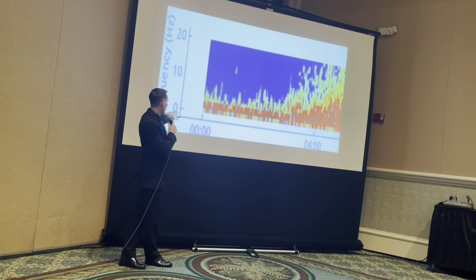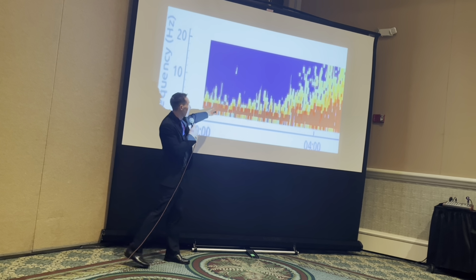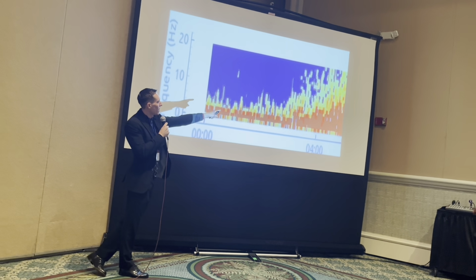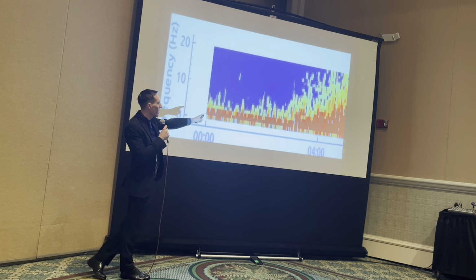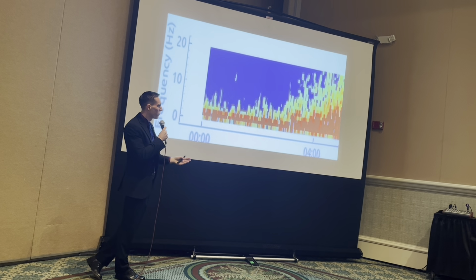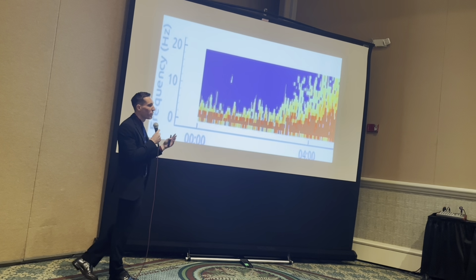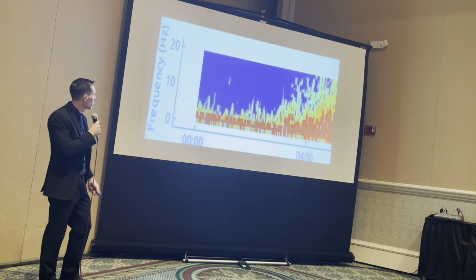So it's starting out, at the bottom, you're going to see delta frequency, slow waves, and over time, at the end, it evolves. You can see the frequency evolve from the slower frequencies to faster alpha and almost beta frequencies up there at the top. And that flame represents the evolution of frequency over time in the patient's seizure.